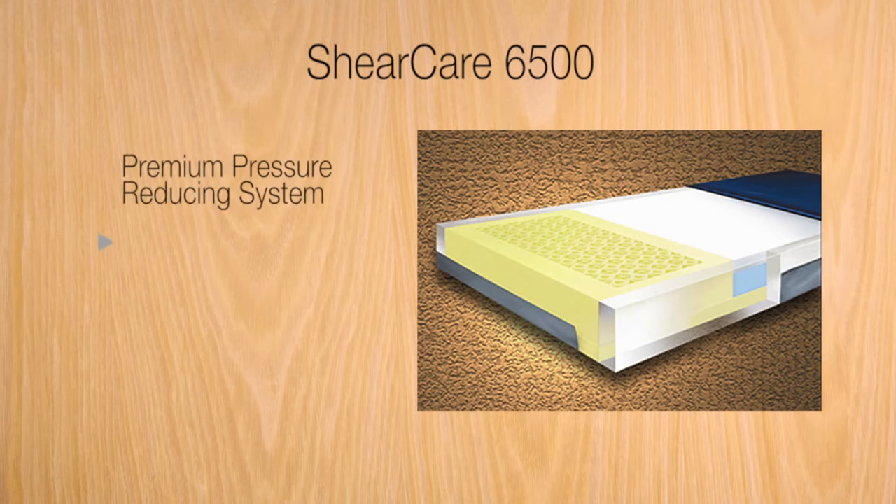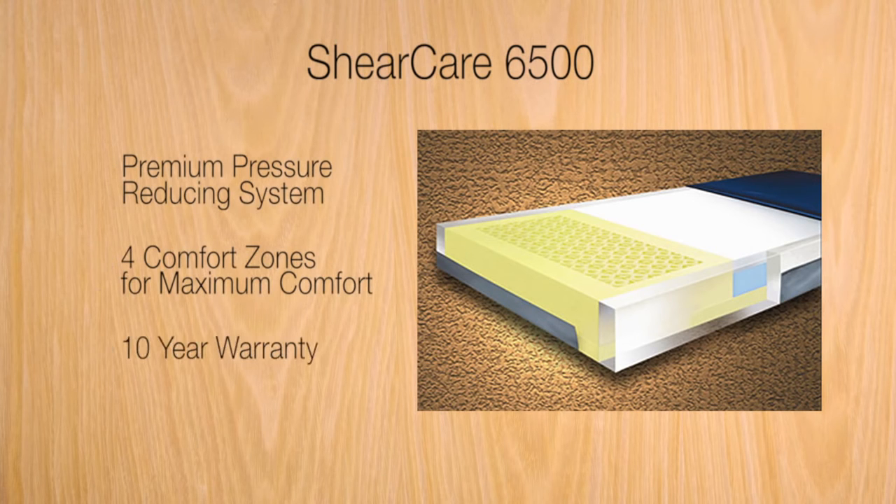All of our beds feature Mason Medical's ShearCare 6500 mattresses. These mattresses have a premium pressure reducing system with 4 unique zones for maximum comfort, support, and pressure relief, and come with a 10-year warranty. As for the rest of the bed, all of our models come with a 5-year warranty.